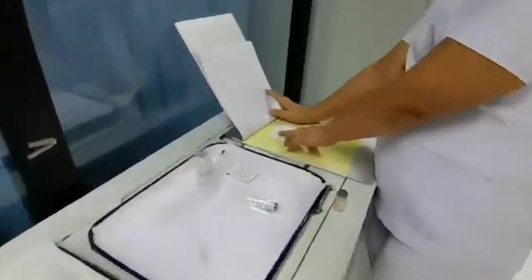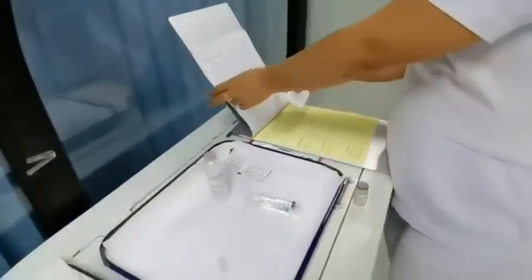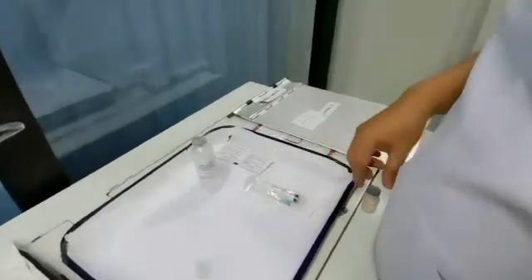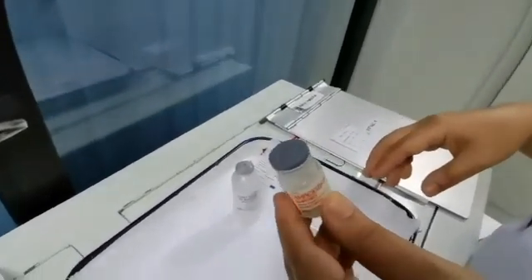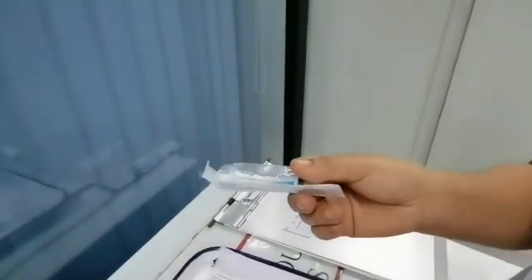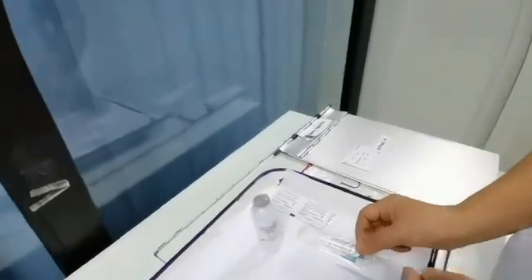Equipment needed. Medication administration record or electronic medication ticket. Vial with prescribed medication. Appropriate size of syringe and needle for type of injection and viscosity of solution. Extra needle.